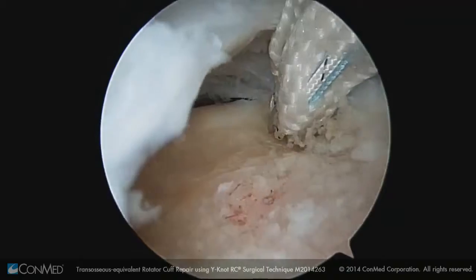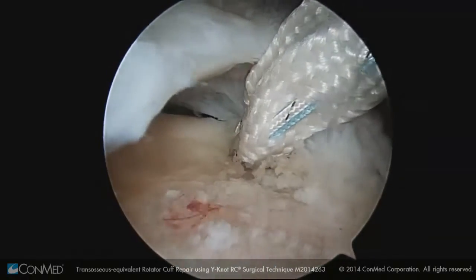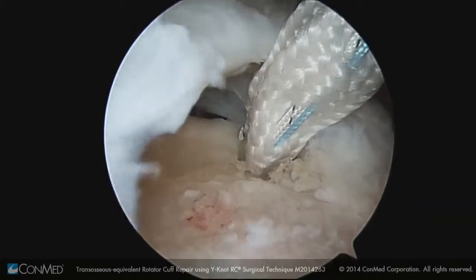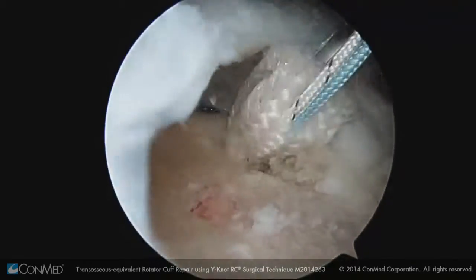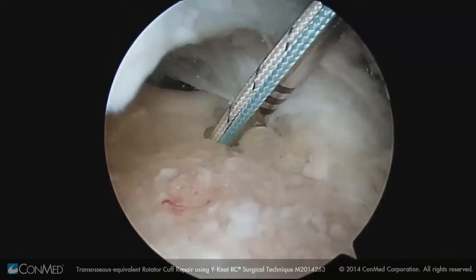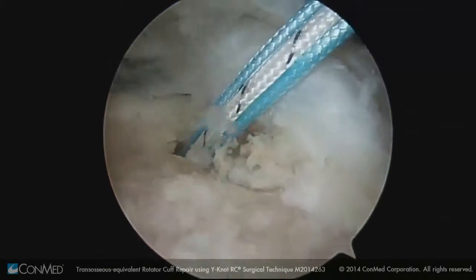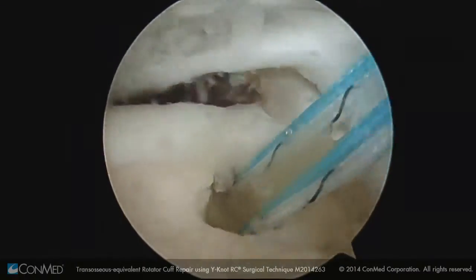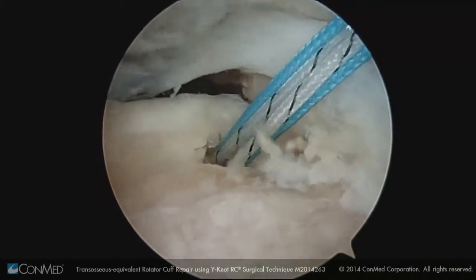Positioning our first Y-knot RC, it has a sharp tip which allows you to position the anchor easily on the cortex. The sharp forked tip allows you to essentially grasp the cortex and position the anchor wherever you want it. I'll typically insert the anchor to the midway point of the hashed lines, and then a firm pullback is required to set the anchor beneath the cortical surface.